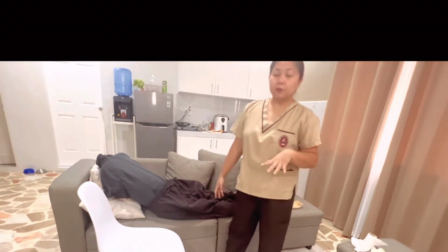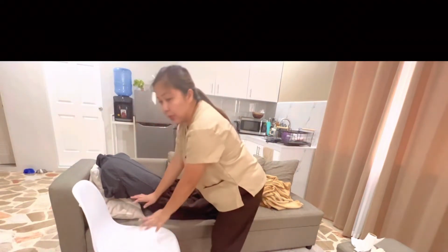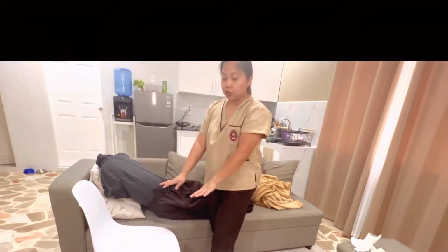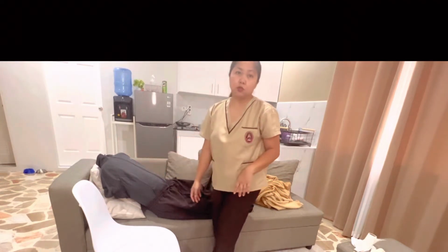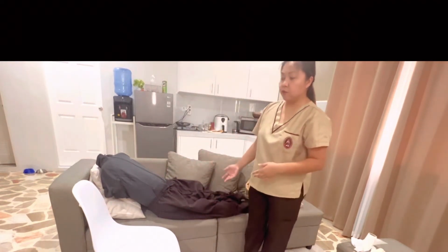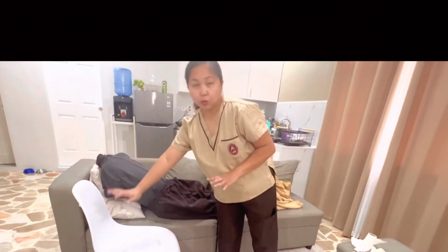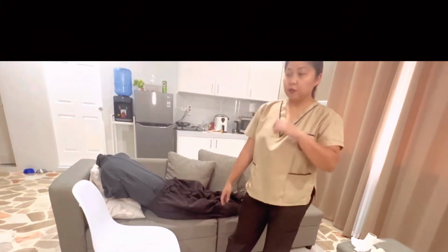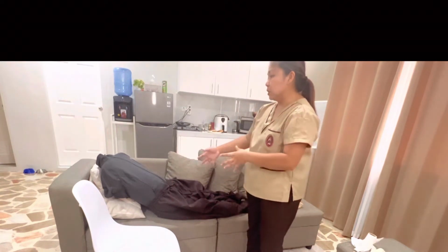And then you would like to place your bedside commode by the bed, parallel to the bed, and just lower the bed according to the level of the commode, and then lower the handrails as well. That way the patient is ready for you to stand. And then once everything is ready, you would like to raise the seat cover or take out the seat cover, depending on your bedside commode. And then just assist the patient to get up in a standing position.